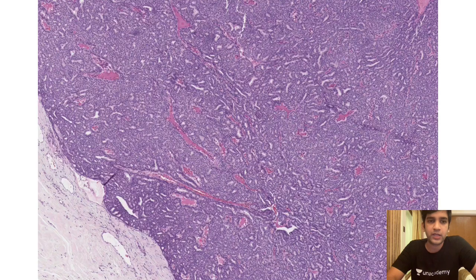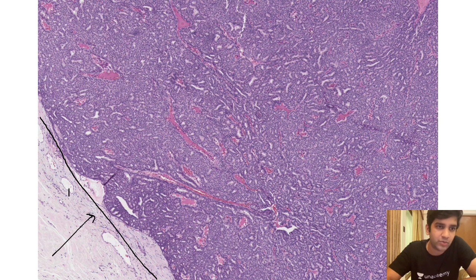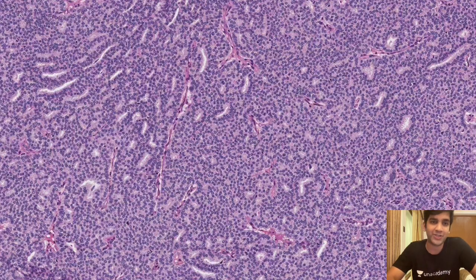See, this is the first image here. This is a scanner view image for sure. But one thing I can say is that this neoplasm is fairly restricted. This might be the surrounding breast parenchyma, with ductules in the stroma. It is not infiltrating, that's what I mean to say. It is a fairly defined, circumscribed lesion, and I'm pretty sure it is very, very solid. I don't have any lumen. I do have some lumen, but it's fairly solid, at least in this power. Most likely a neoplastic lesion, but let's go to higher power and then make a decision.